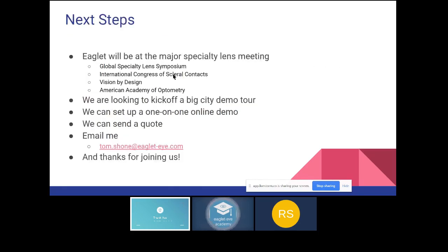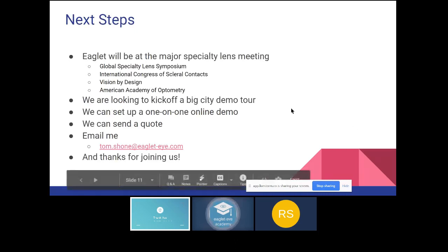So with that, if there's any questions, jump on the chat. And it doesn't look like there's anything yet.